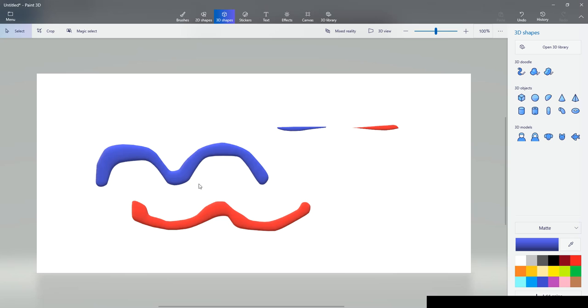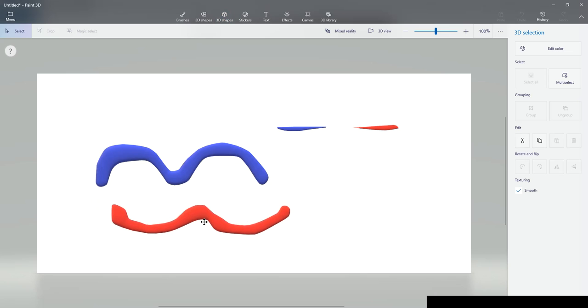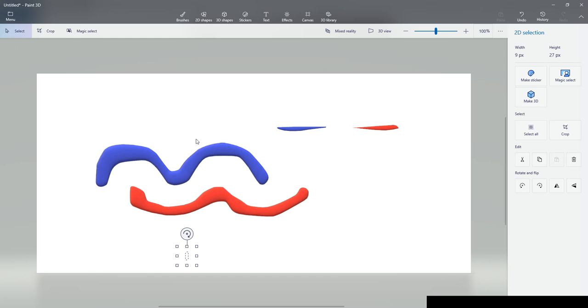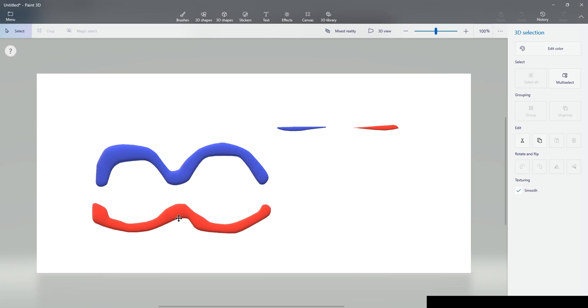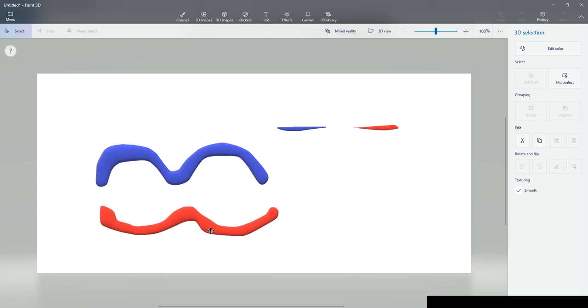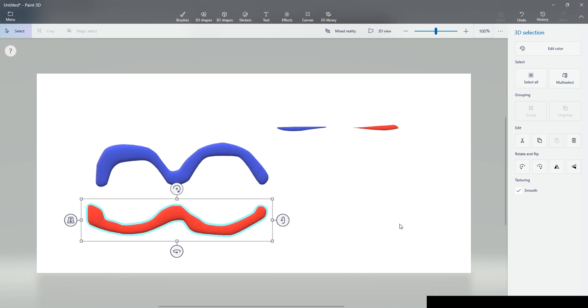For the first item, we can see paradoxical septal motion in echocardiography. This is the paradoxical septal motion, and this is the normal motion. And this is the paradoxical septal motion, but this is the normal contraction. You must think about the motion of the valve.